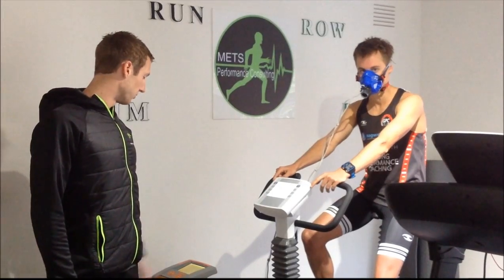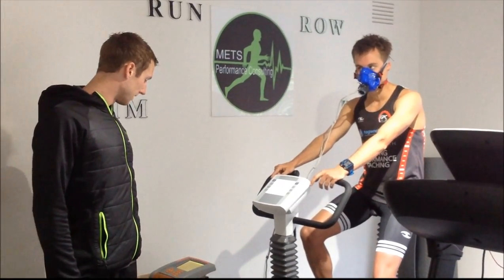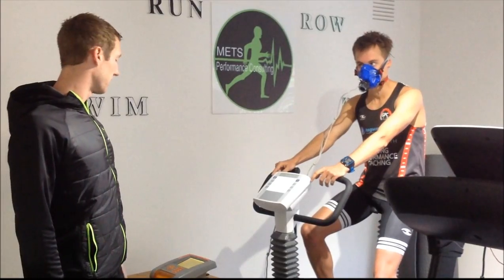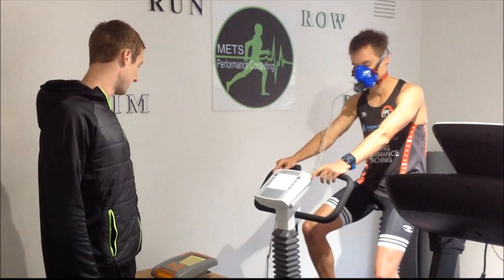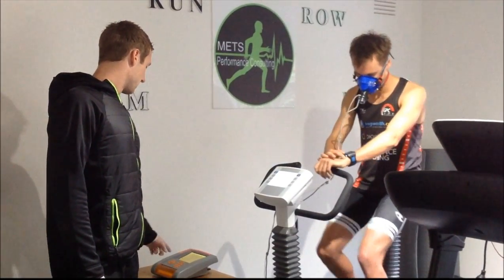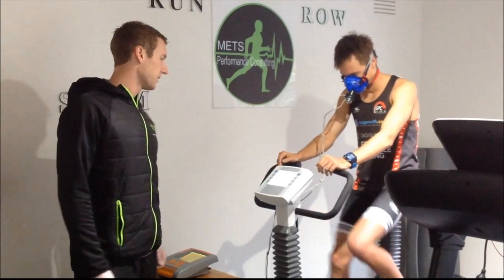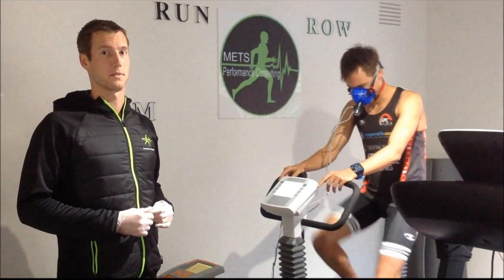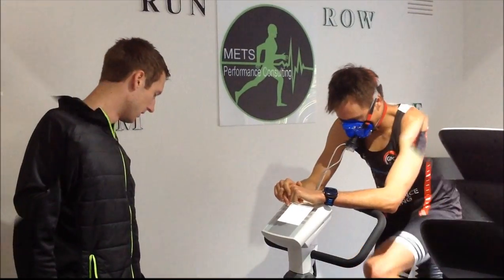At the moment we've just got him getting some resting values. In about 10 seconds we will change the phase into a warm-up phase, so he'll be cycling at 50 watts. After this we'll start him out at 90 watts and we're going to increase that by 15 watts a minute until he can't go any longer. From that we're going to get a nice linear curve and we'll be able to get his heart rate training zones, which he can then use during his base building phase to optimise his training performance.